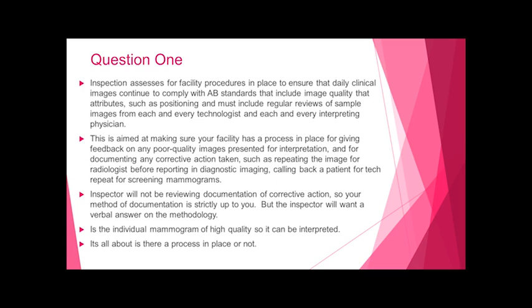All right, let's talk about the EQUIP question 1. Inspection assesses for facility procedures in place to ensure that the daily clinical images continue to comply with accreditation body standards that include image quality attributes like positioning, contrast, compression, and so on.